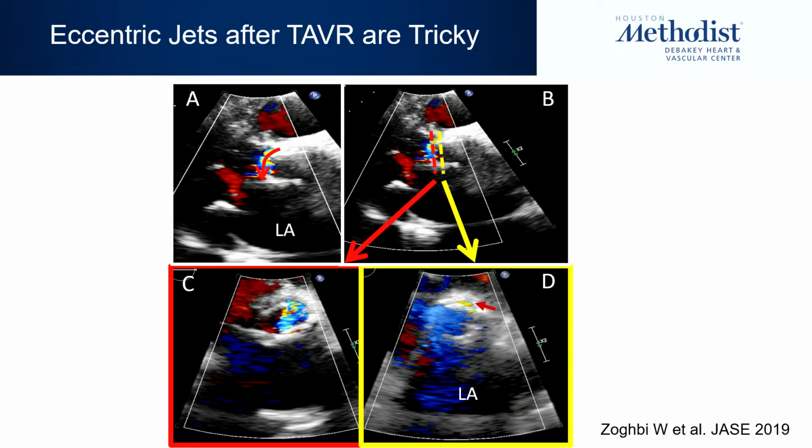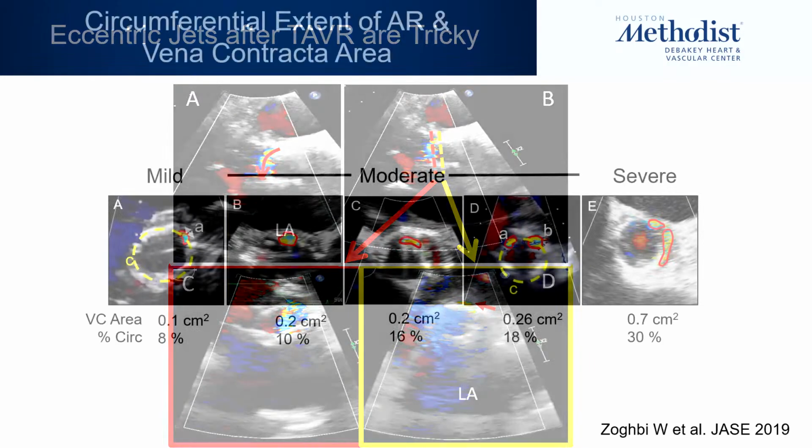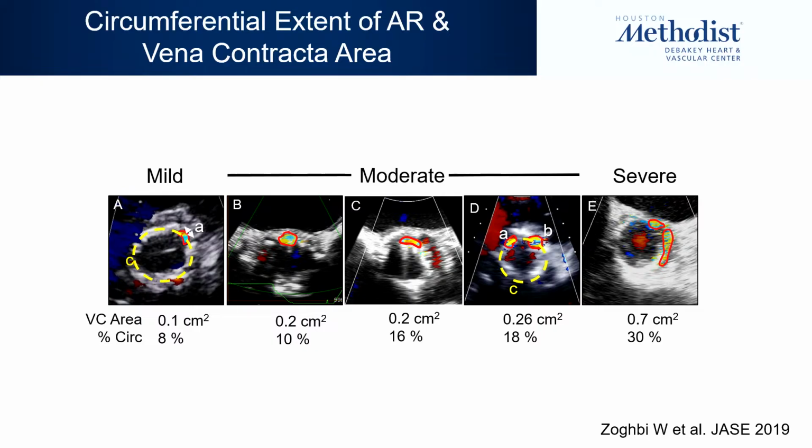Remember, this is a frame. So you're going to see part of the frame all the way through. So you try to identify exactly where that area is. And this is probably the best measure by color Doppler of severity, the vena contracta area. And you can have one area alone. You can have a small spread area, just like in this example, or you can have very extensive multiple areas. So therefore, it is up to the sonographer who's doing the study to maximize this view.